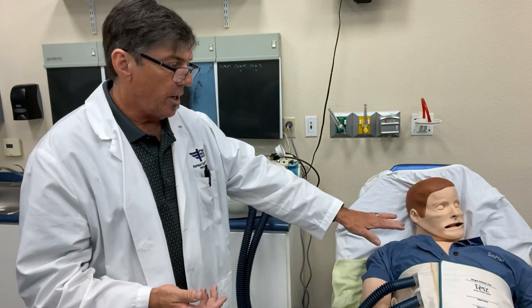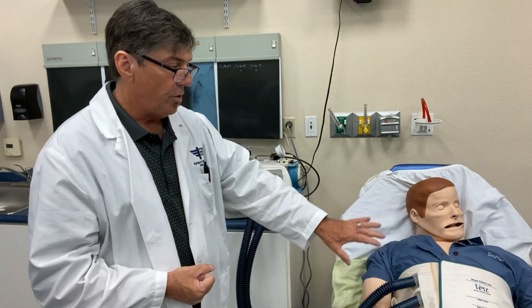There are various sizes from small, medium, large, and extra large. The goal is to wrap the disposable vest around the patient's thorax, around their chest, and connect the simple connections up. Run the physiotherapy for generally 10 minutes or whatever the physician has ordered. There are controls for the frequency — how fast the vest will vibrate — the intensity, and a timer so you can run therapy for the prescribed amount of time. Encourage the patient to cough after the therapy is completed.